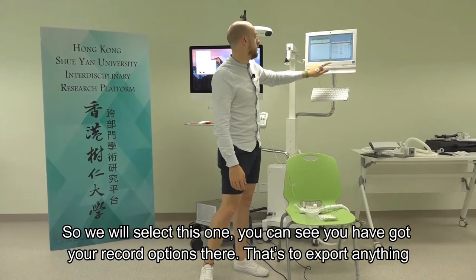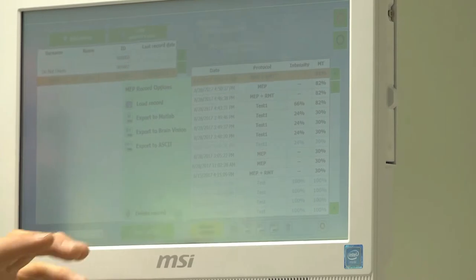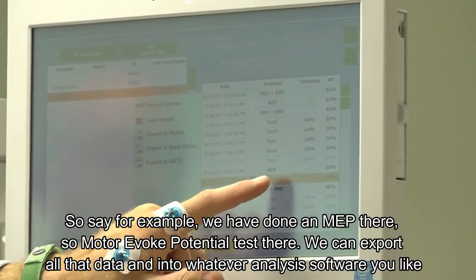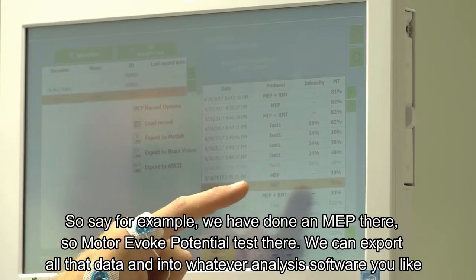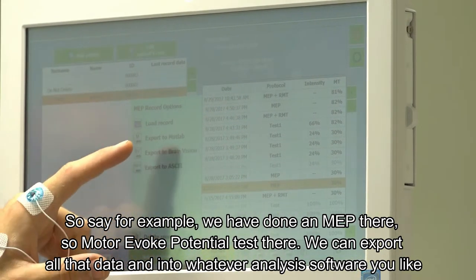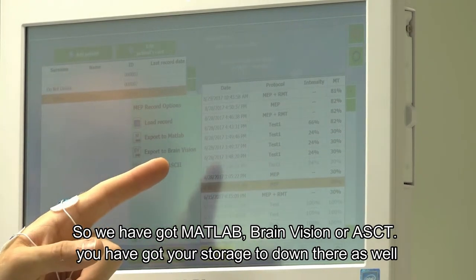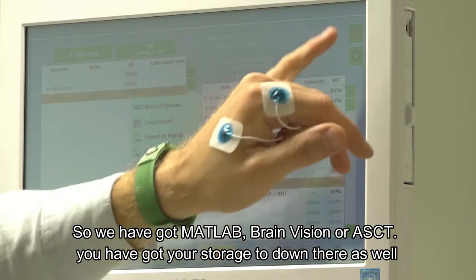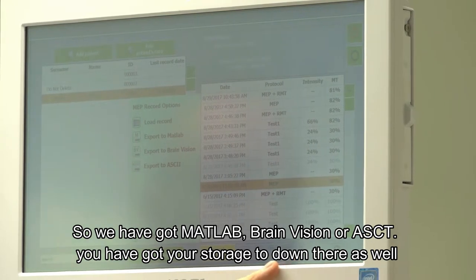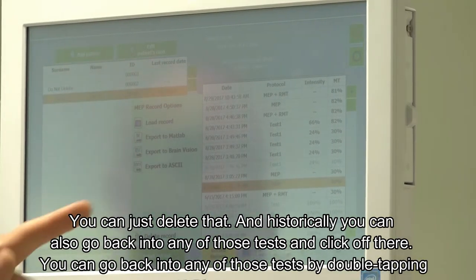Always bear in mind that you should never delete all patients - always leave at least one. If you delete all of them, the software goes haywire and you can't create a patient from zero. We put one on there labelled 'do not delete' - if that stays, there can't be any problems. You've got record options to export data from an MEP test into MATLAB, BrainVision, or ASCII format. You can also delete inconclusive tests and go back into any historical tests.